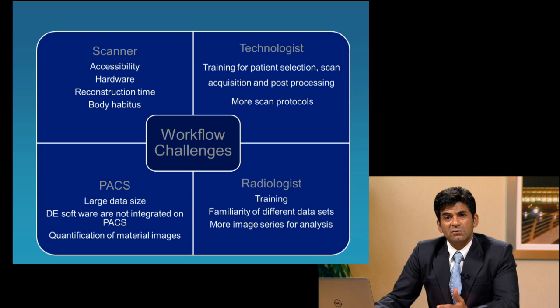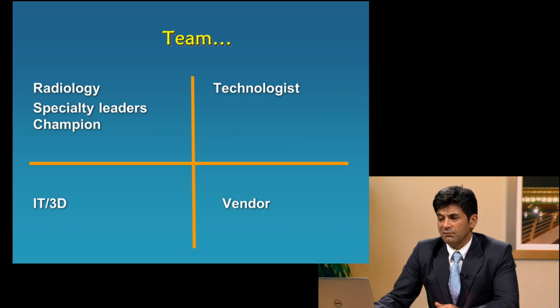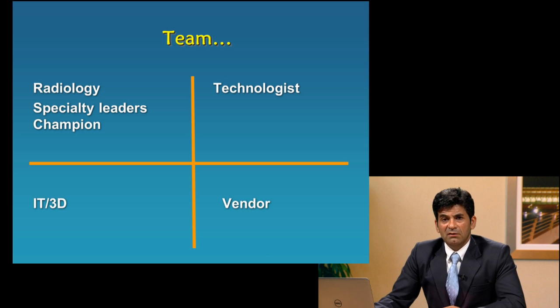The radiologists need to understand how to interpret these images and what these images mean for clinical care. So there are certain workflow challenges that one needs to confront. And these can be overcome by creating a team.